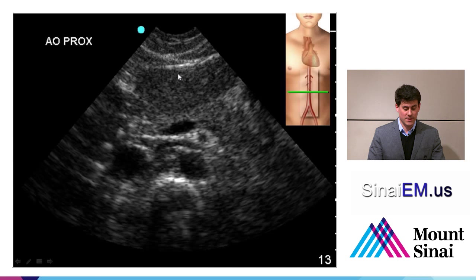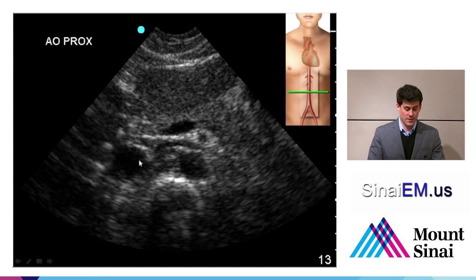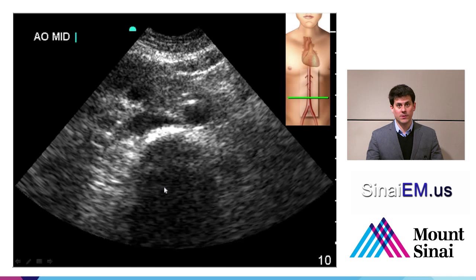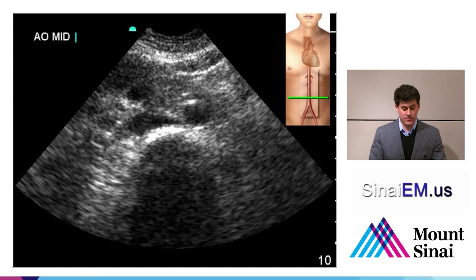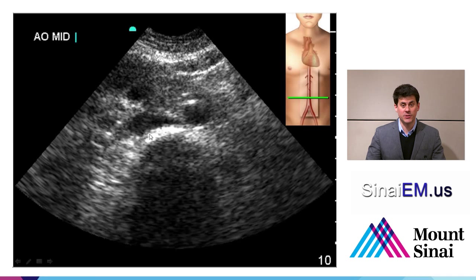From top to bottom: liver, pancreas, splenic vein, superior mesenteric artery, left renal vein going transverse into the inferior vena cava, the aorta, and the lumbar spine — vertebral body with shadow. As you go more distal, there's less anatomy to appreciate because most of what you see is bowel, but you can still identify the aorta and the inferior vena cava sitting on top of the brightly echogenic anterior edge of the vertebral body.